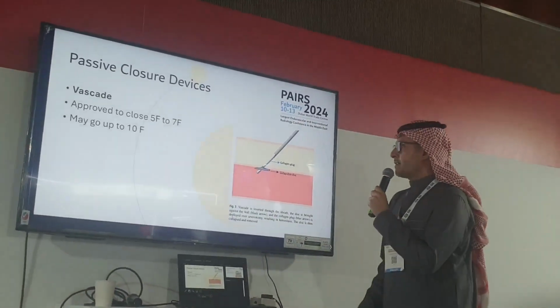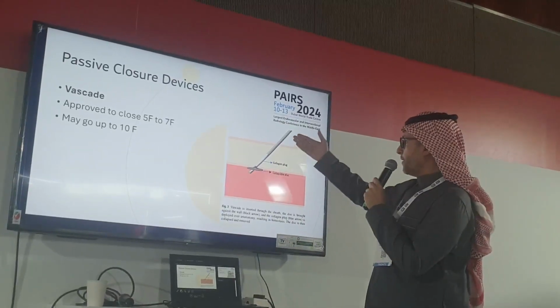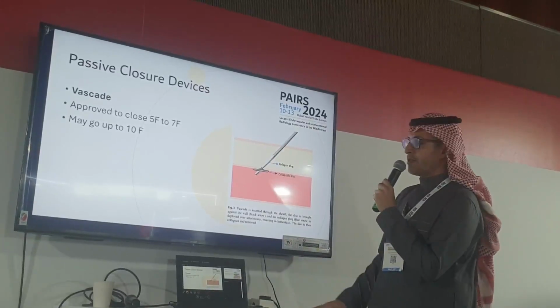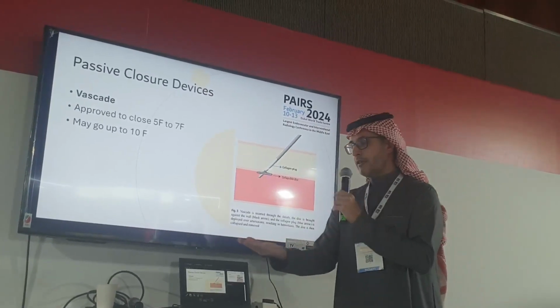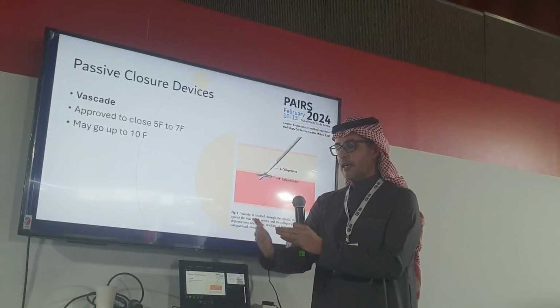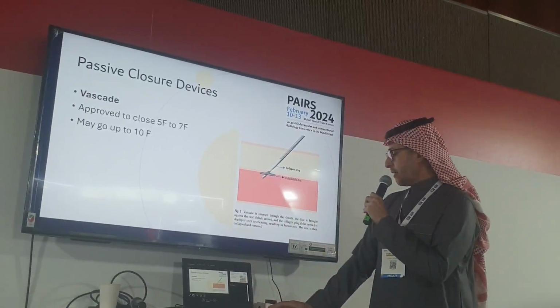The Vascular closure device is basically the same idea. You put in the plug, but to place the plug abutting the wall, you use a collapsible disc. The disc will be intraluminal, and you apply the plug, and once it's in a good position, you just pull up and collapse the disc and pull it up.